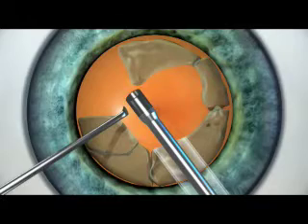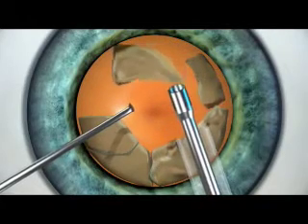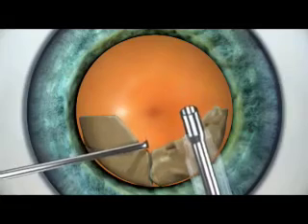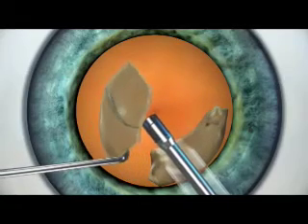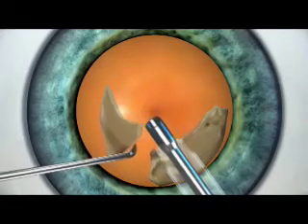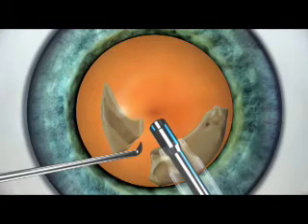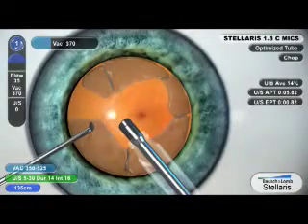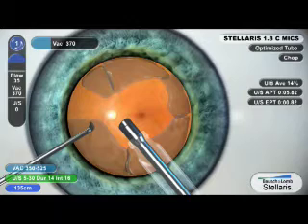Lens removal is efficiently achieved with Stellaris through this combination of mechanical cutting and cavitation, concentrating the energy of linear ultrasound into a focused force directed into the nucleus to emulsify the lens, rather than dissipating the energy within the eye as with other system needle movements. Together, improved stroke length and frequency focus ultrasound power into the nucleus for efficient cataract removal.